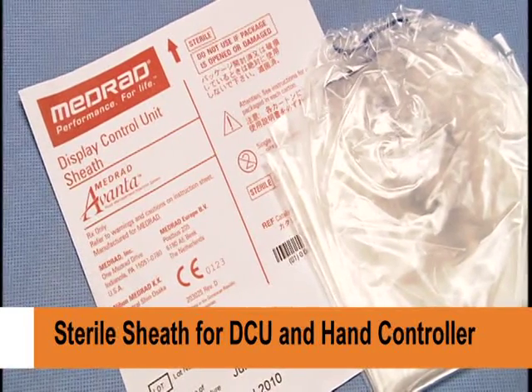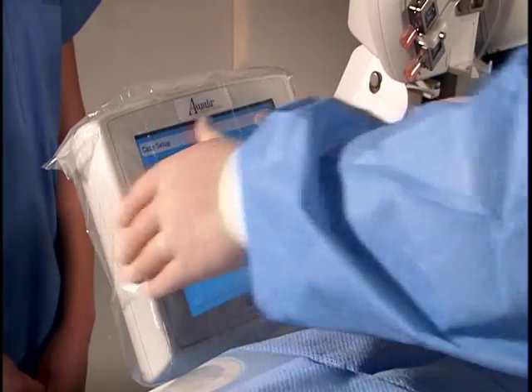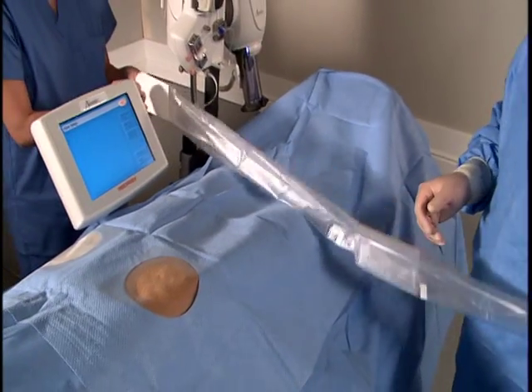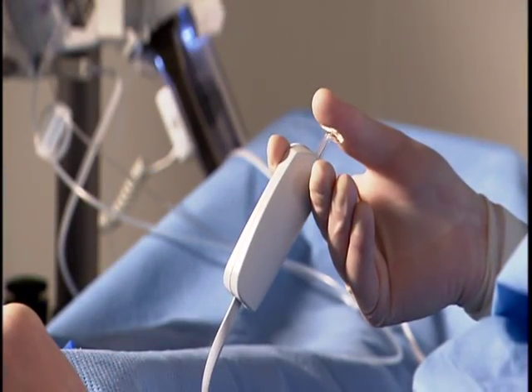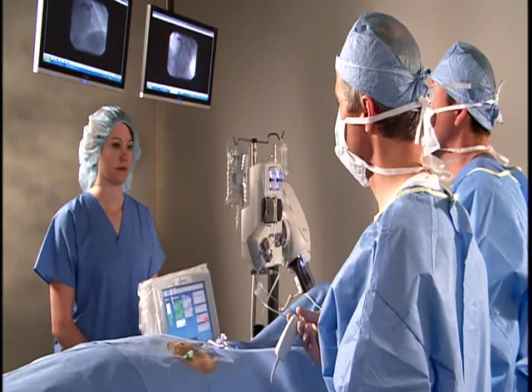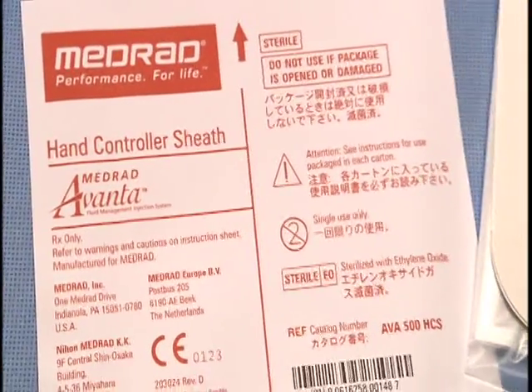Accessory single-use disposables include the sterile sheaths for the DCU and the hand controller. The DCU sheath covers the entire display control unit. The hand controller sheath fits over and around the hand controller and cable assembly and is attached to the FCM. Note that the hand controller can be used as a multi-patient or a single-use disposable. When employed as a multi-patient disposable, it can be used for up to 5 patients with a single-patient sterile sheath.